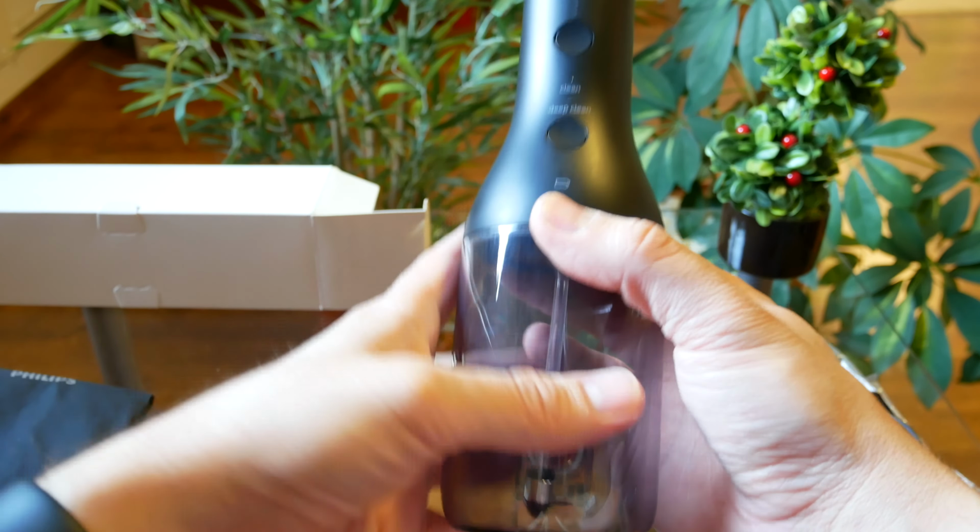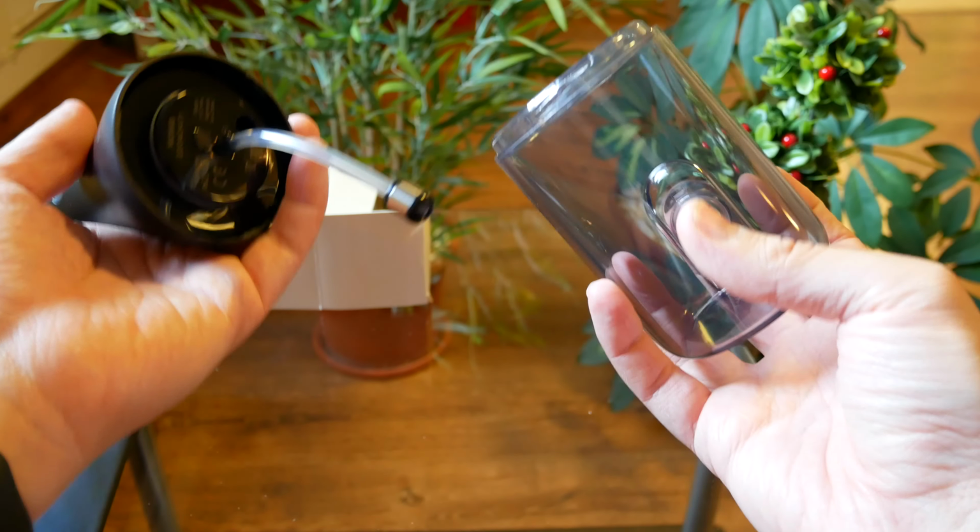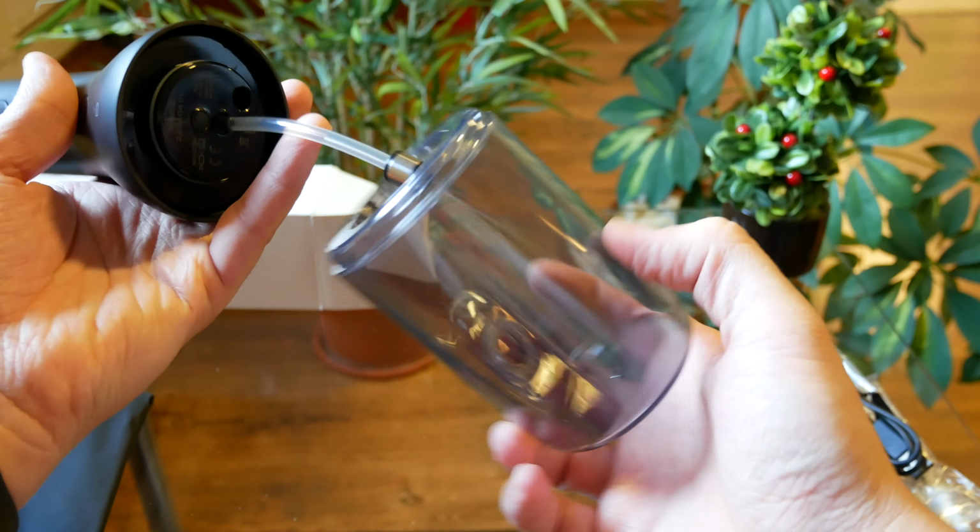Yes. This is very nice because you can actually clean this very well. Other irrigators had this opening very narrow, and it was very difficult to properly clean the reservoir. I think you can dishwash it. We'll have to check the manual to see if it's possible, but you can definitely wash it very well.